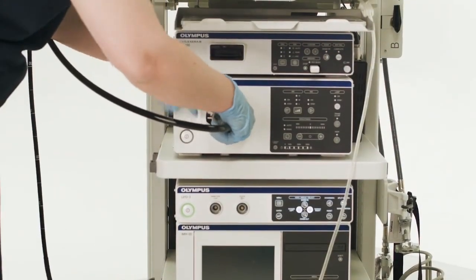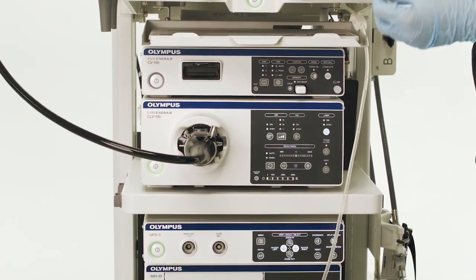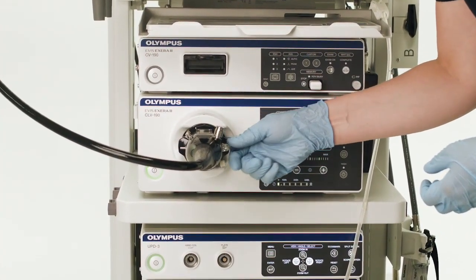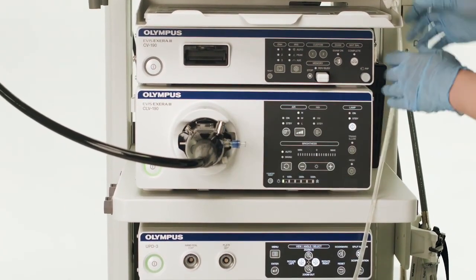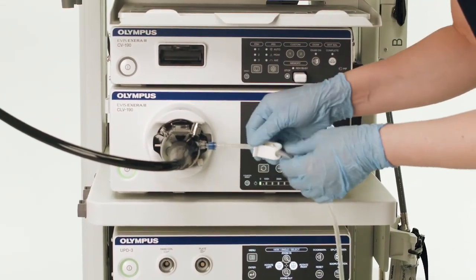For your next case, attach a new MAJ 1652 auxiliary channel adapter to your next endoscope as instructed previously. Then attach the scope via the fresh adapter to the MAJ 1651 tube set. Remember to disengage the pinch clamp and prime before use.